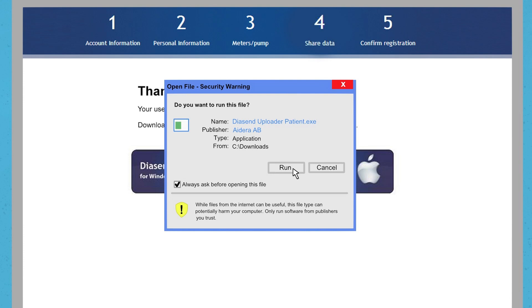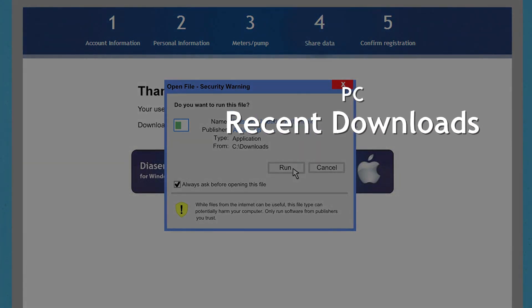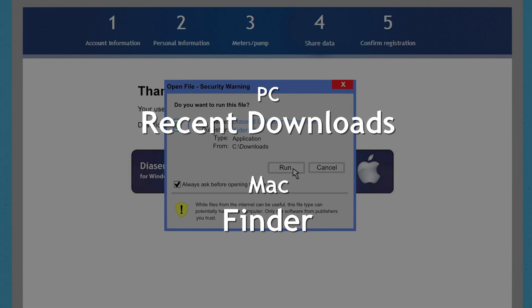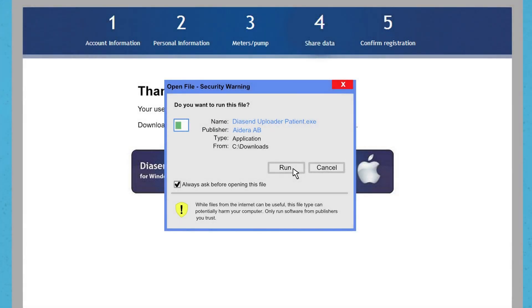Note that depending on your web browser, you may need to search for the downloaded installation file in your recent downloads folder on your PC, or in Finder if you're a Mac user. Or you may just automatically get the popup window on screen to run the file.